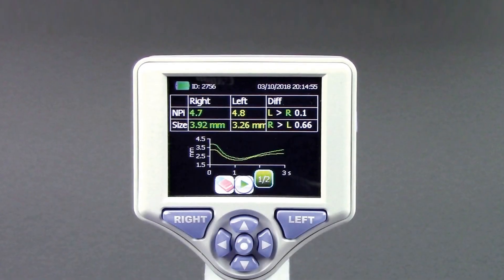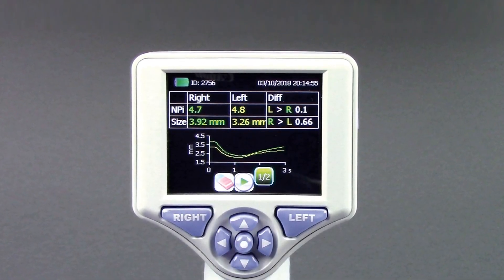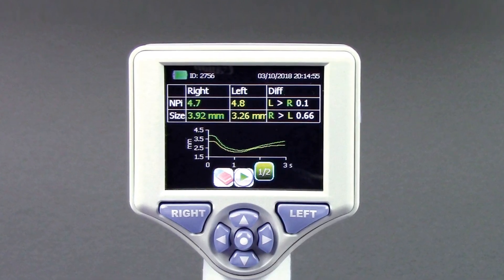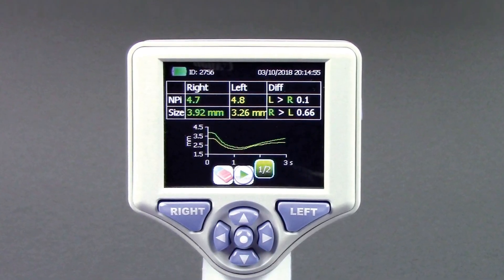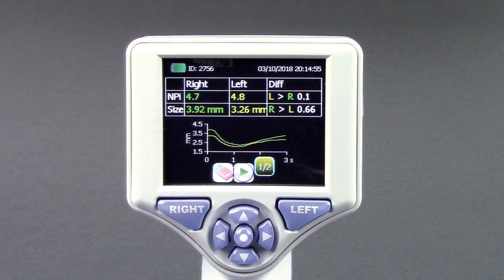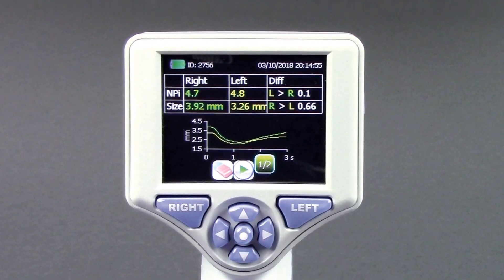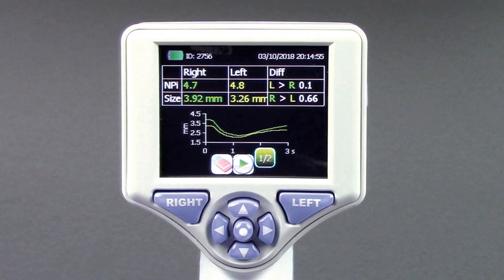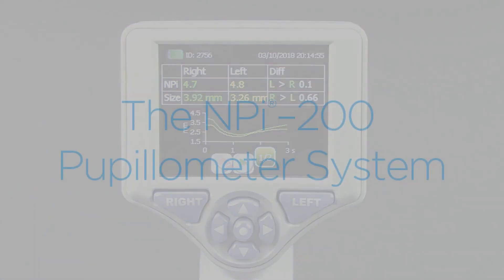Automated pupilometry provides accurate, reliable, and objective pupil measurement independent of the examiner. By removing subjectivity from pupillary evaluation, the NPI 200 pupilometer provides benefits to clinicians and patients through its ability to detect subtle pupil changes and to trend these changes over time.